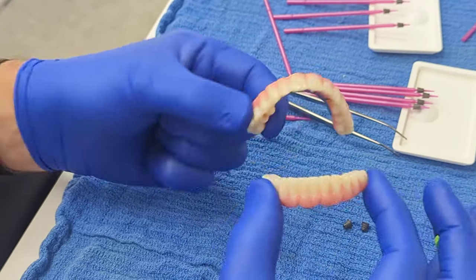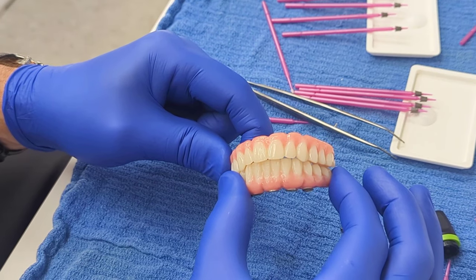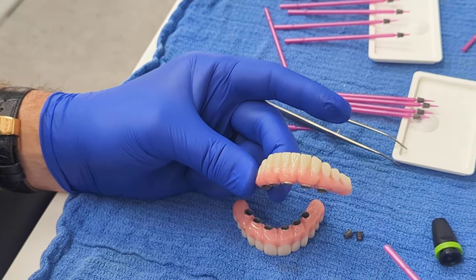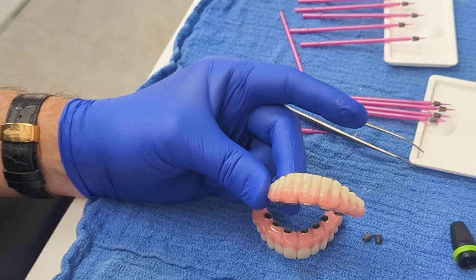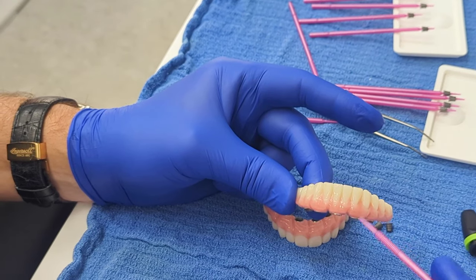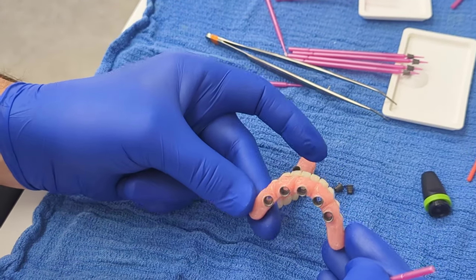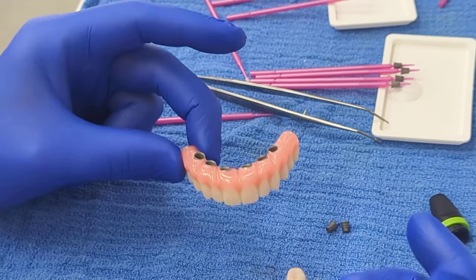So I have the adjustability of these teeth, not only to get my centric stops once I deliver, but also to get my excursions. And if for some reason after I deliver, I find out that I can't thread through here easily enough, which means that Lisa won't be able to thread through here, then really what we have to do is take it out, customize the intaglio of the surface, and make sure that the patient can actually get in there easily.